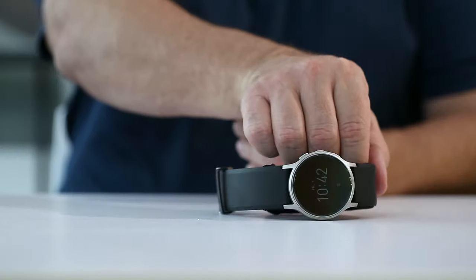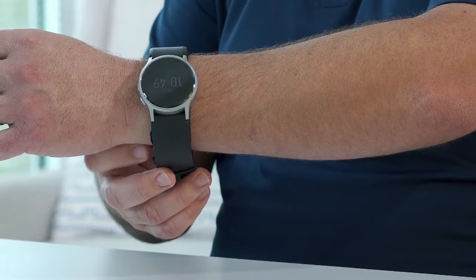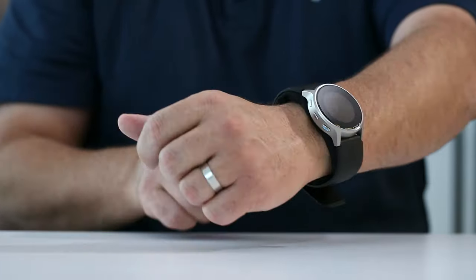Begin by placing Heart Guide on your wrist like a traditional watch, with the monitor positioned on the outside of your wrist.